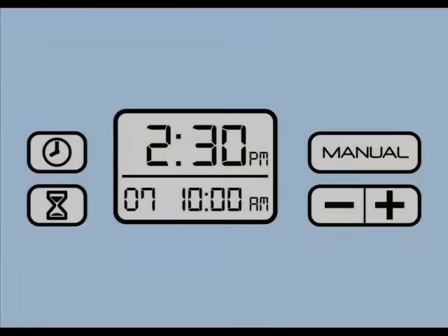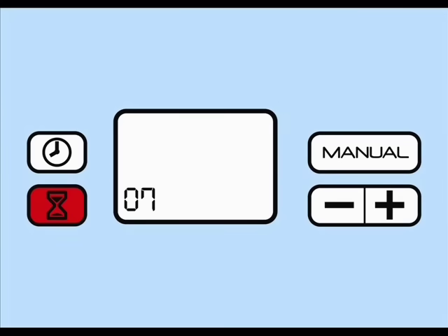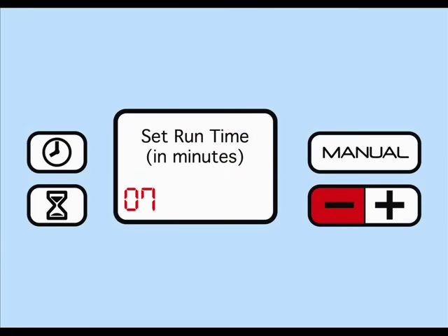If you wish to change these settings, it's easy. You can do this by pushing the hourglass button. You'll then be prompted to set the runtime — that is, how many minutes the SoClean operates during its daily cycle. Increase or decrease these minutes by pushing the plus or minus buttons. 5 to 10 minutes should be enough to completely sanitize your equipment.